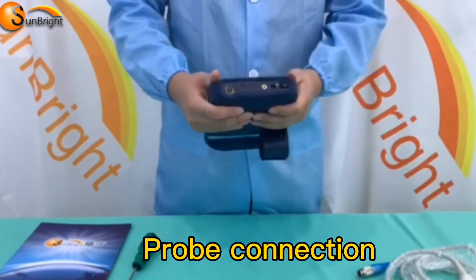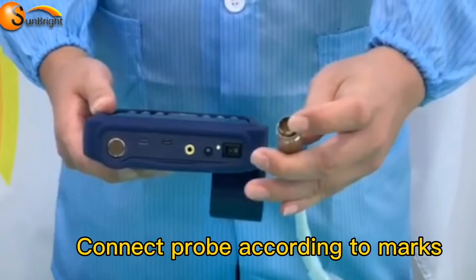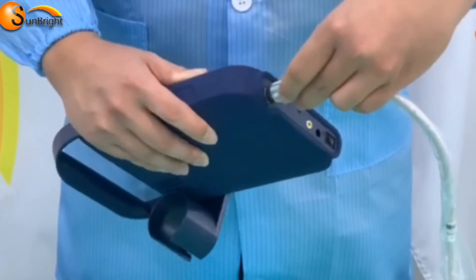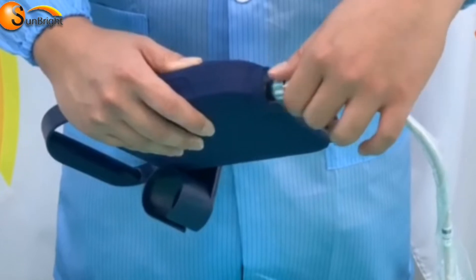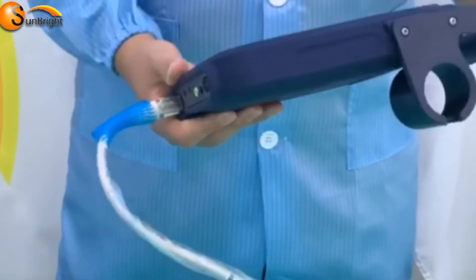Probe connection: latch the marks of both the probe connector and the probe. Put the probe into the probe connector along with the marks. Rotate the sleeve clockwise to lock the probe, then put the probe on the probe holder.